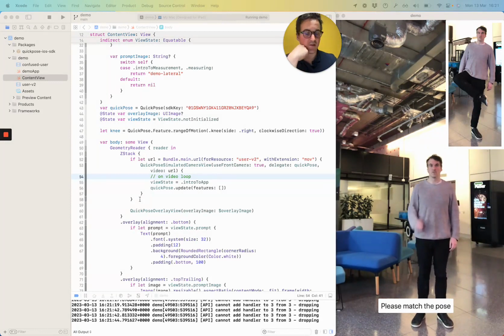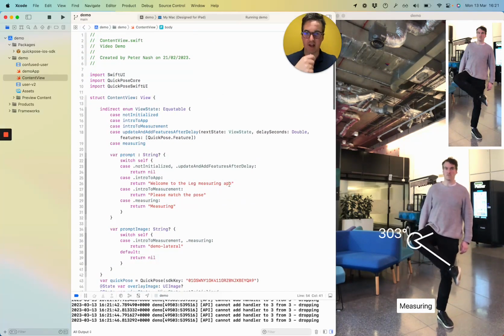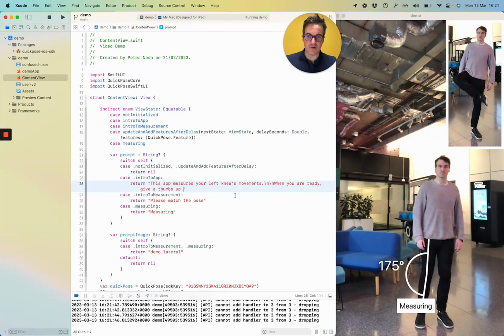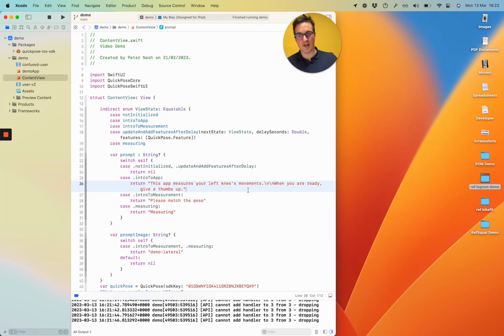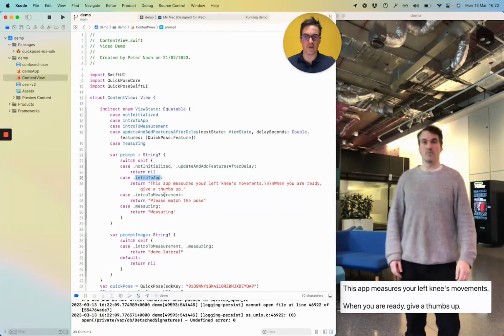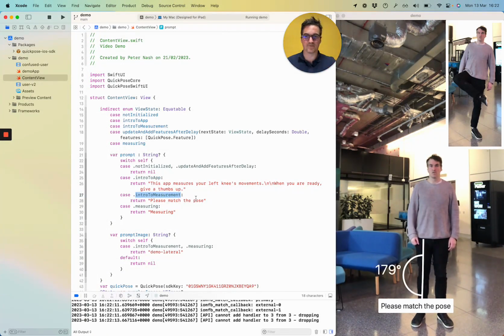Okay. So my intro to app now, I want that to have a slightly more detailed prompt. So it's now going to say, this app measures your knee's movements. When you're ready, give a thumbs up. So let's just run with that. And then between intro to app and intro to measurement, I want it to wait.